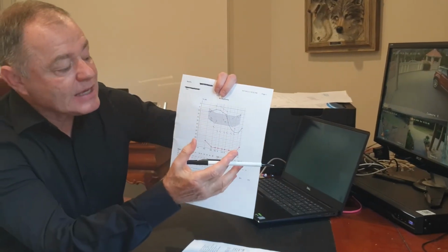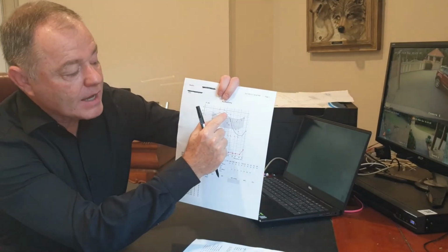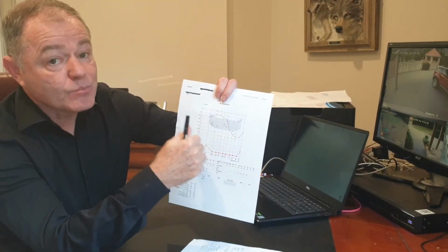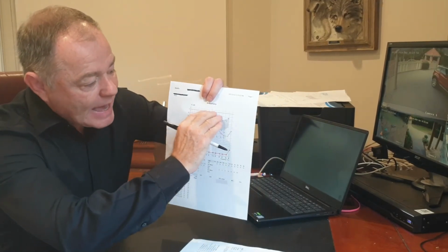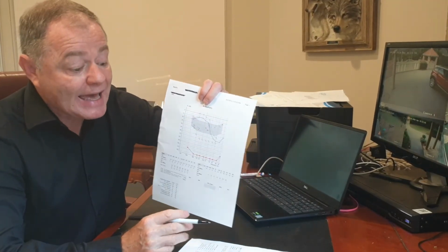So the idea of a hearing aid is simply to amplify each frequency in proportion to the degree of loss that you've sustained, and then balance that out as best we can, and also as best as what you can tolerate. So the two need to go hand in hand. You need to adapt to the change of what you're hearing, because you've got conditioned to your hearing loss. You may have got used to not hearing high-pitched tones. You've now got to get used to hearing those sounds again.